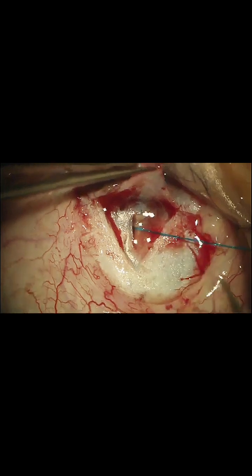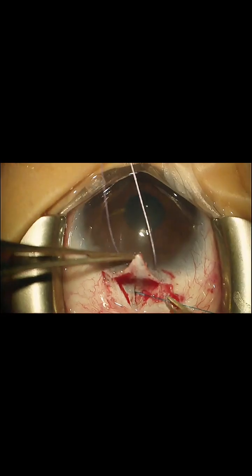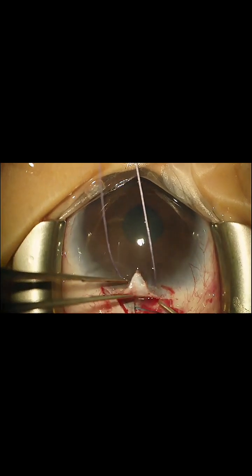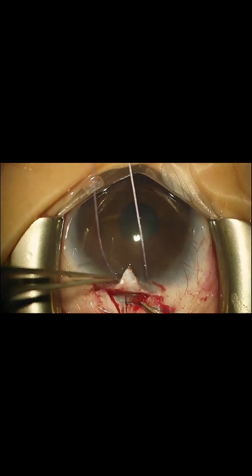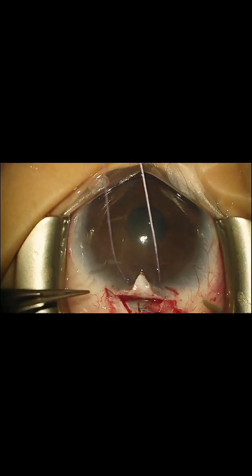Before I do anything with the trabeculotome, I'm going to try and confirm where we are with this 6-0 Prolene. So I'm taking the traction off here. Let me zoom out a little bit. And you see how easy that advances. We're looking to make sure that it's not in the anterior chamber when we strum it here. I'll take another piece of that 6-0. I'm going to cannulate the other direction.